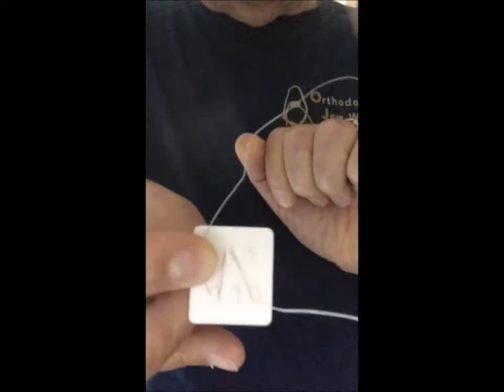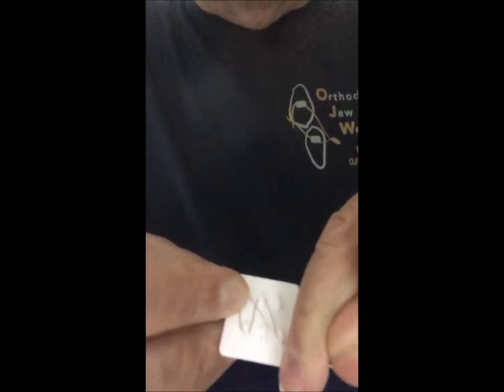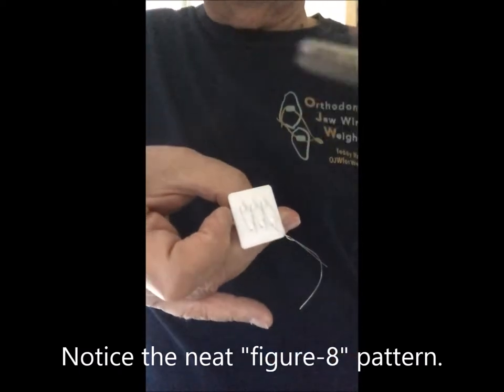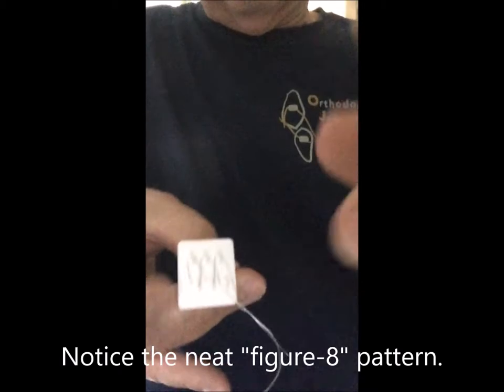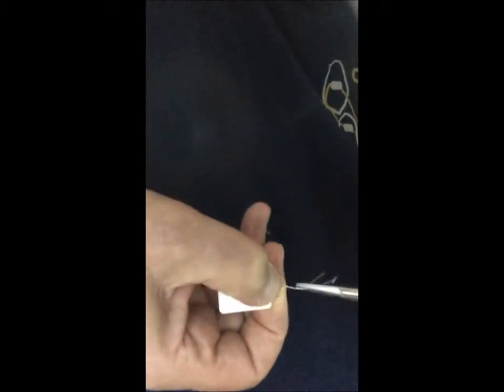Then they would take the top half of the wire, wrap it around bracket number four, up around bracket number five, meet the two ends, twist, then take the twisting wire instrument, wrap it, grab the two ends of the wire, and then make a little pigtail: one, two, three, four, five.